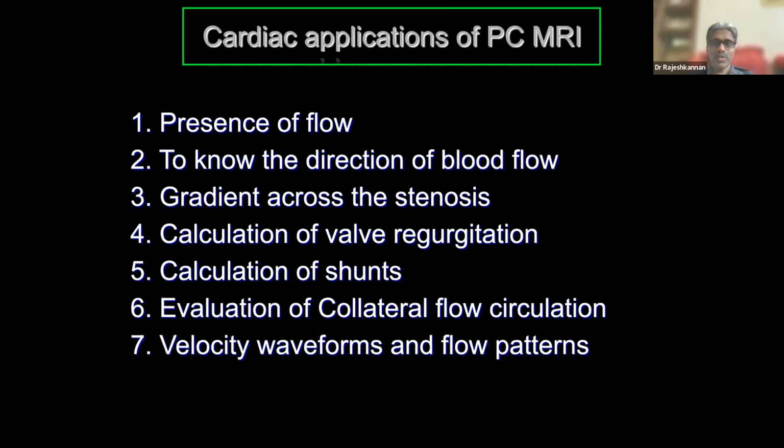Yes. Of course, we have the recent, newer techniques like 4D flow, where once we acquire the 4D data of the entire chest, we can do a reconstruction later. So I will come to that point.